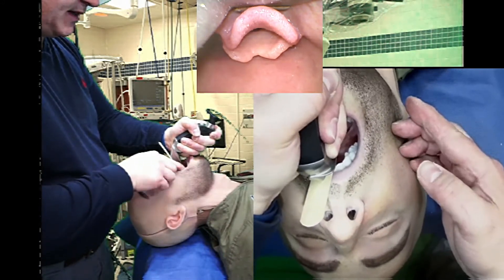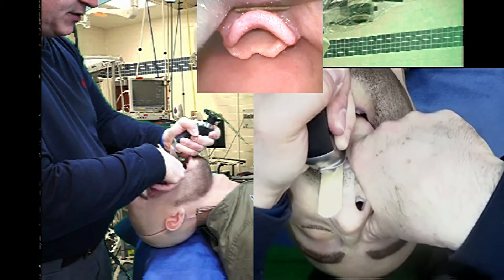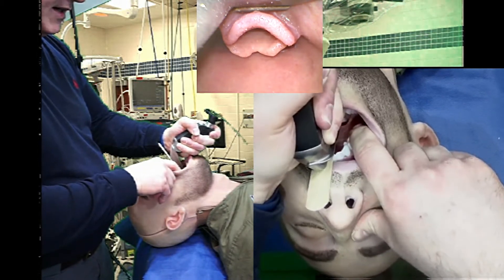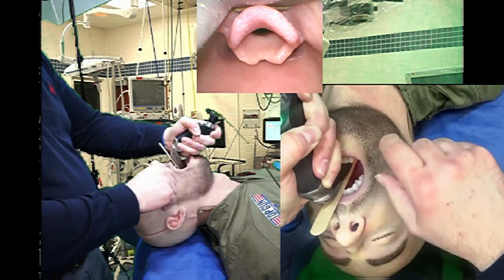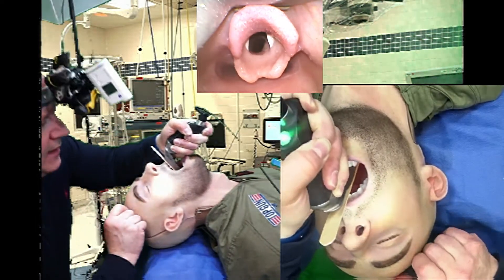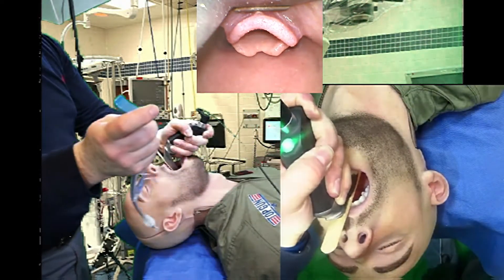What I'm going to do now is the salad poke, where I stick my finger into the mouth to make sure that the tongue is not hanging over the delivery channel of the tracheal tube. It's free and clear — grade one on video laryngoscopy. I'm going to bend over and I'm getting grade 2A; this mannequin is a little bit low for me.